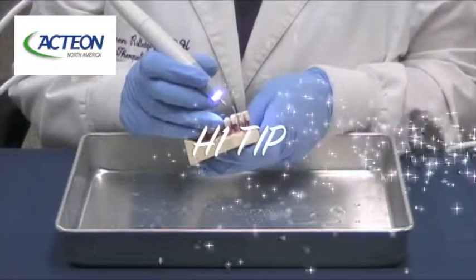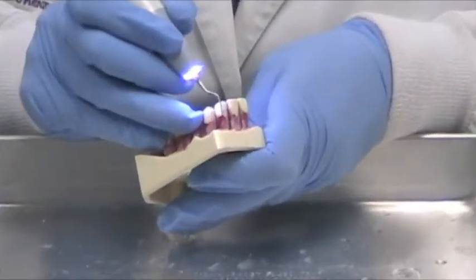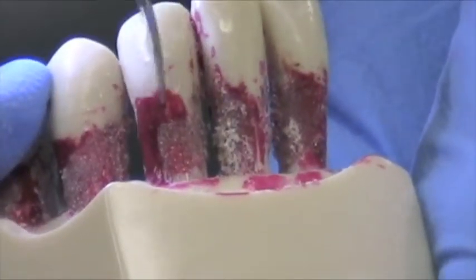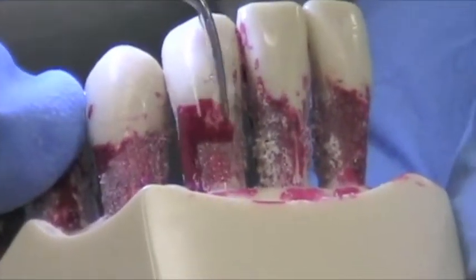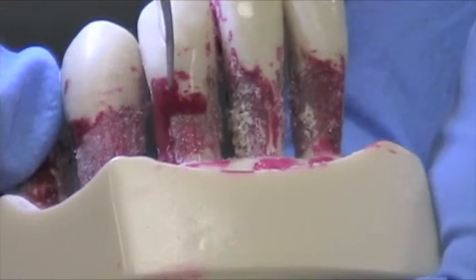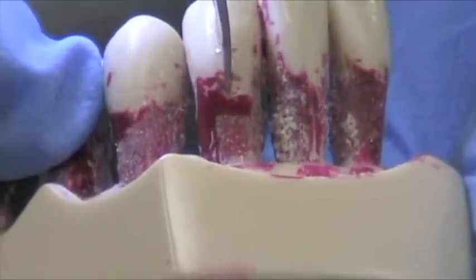Now we're going to demonstrate the H1 tip. The H1 tip is for anterior teeth. It's used for burnished calculus, for conservative root planing, and for smoothing the rough CEJ. You're using that same sweeping action, kind of a slow methodical crisscrossing. Very, very light pressure — let the tip work for you.